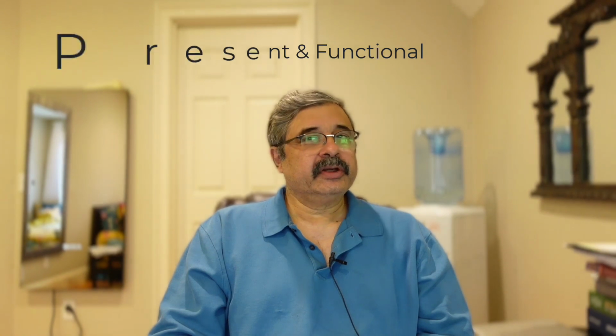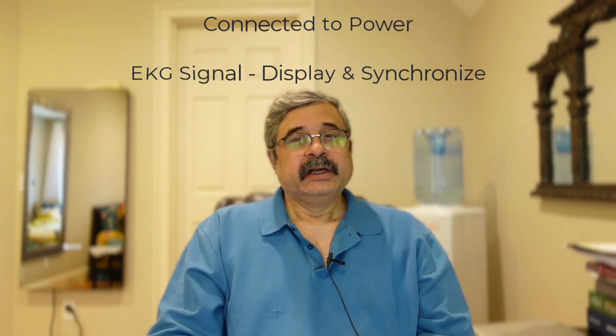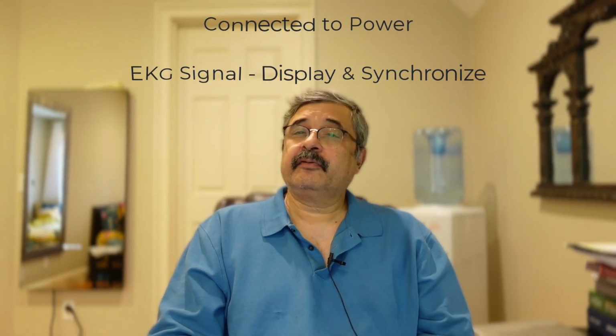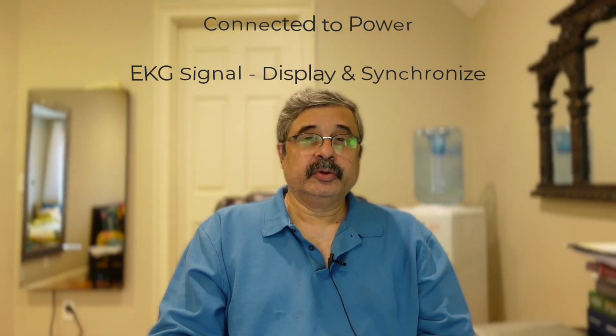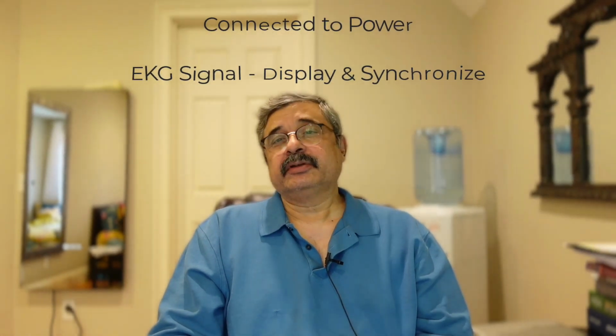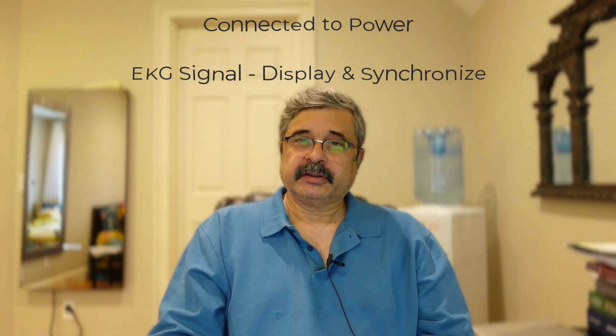Functionality implies ensuring that it is connected to power and can be switched on. You should also know how to either slave the EKG signal from the main monitor to the LifePak or use directly applicable skin leads to get the EKG signal from the patient into the LifePak monitor.